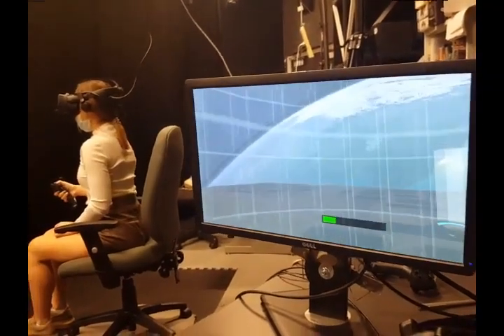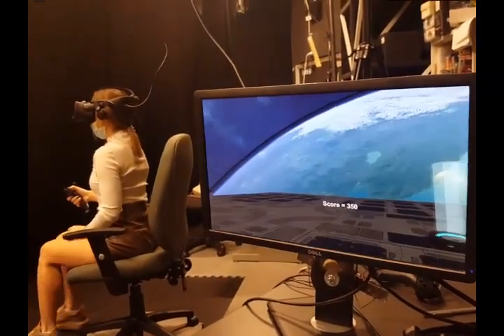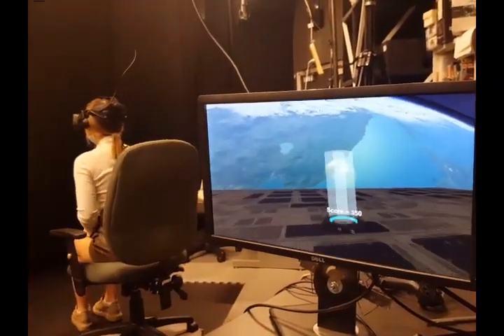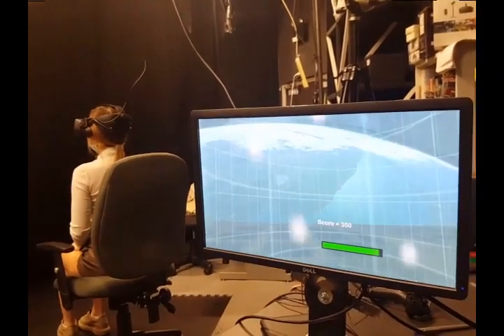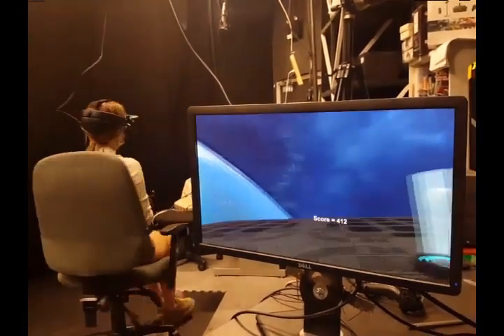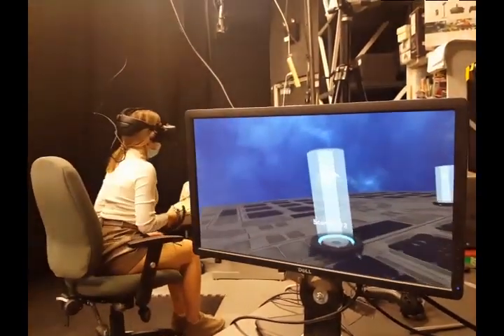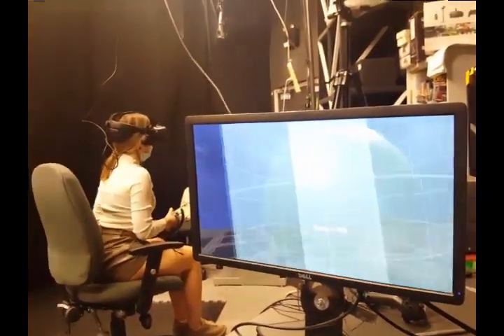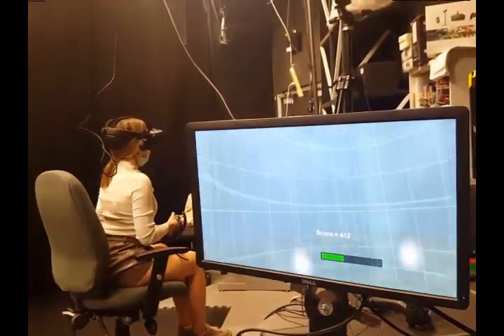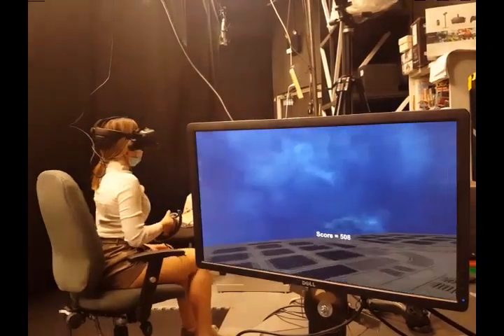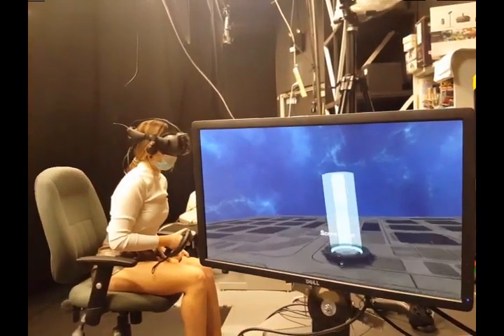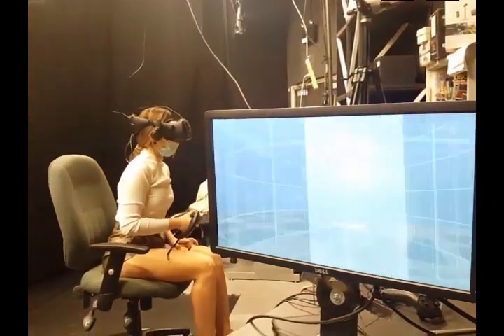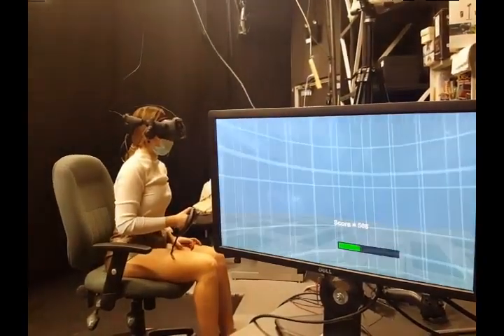This video shows the reach the target task where the participant needs to stay inside each target for one second to get the score. In this video, the participant is using the head joystick condition.